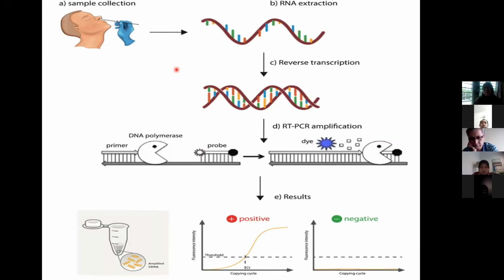However, we have to think about the process along the way: the extraction, the purification, and the addition of some chemicals or enzymes. During that process, there might be some contamination. Based on our experience, the fluorescence probe is prone to being quenched by any organic compound existing in the vials or during the detection.